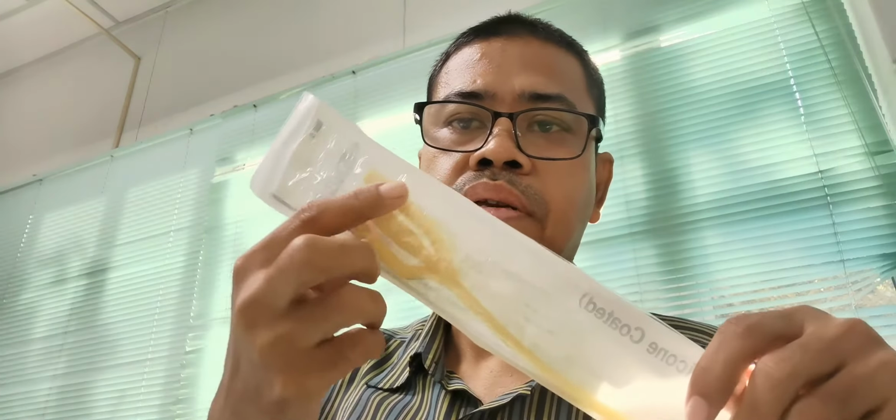So what are the sizes of CBD? You can have various sizes in adults: 16 French, 18, 20, 22, the biggest is 24. You can have a normal catheter, or you can have this triple lumen where you can irrigate.